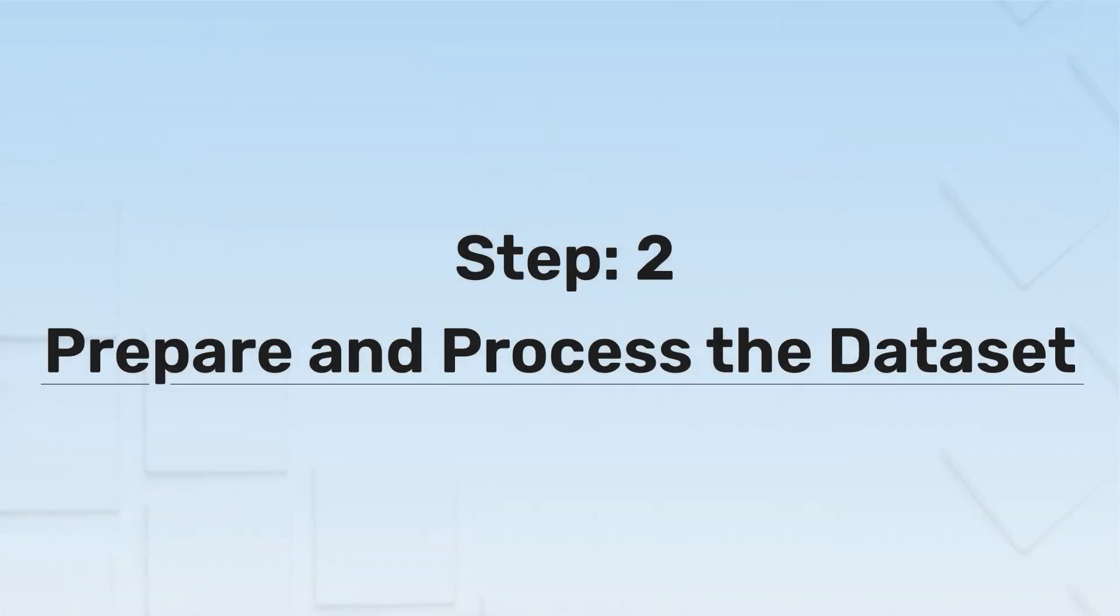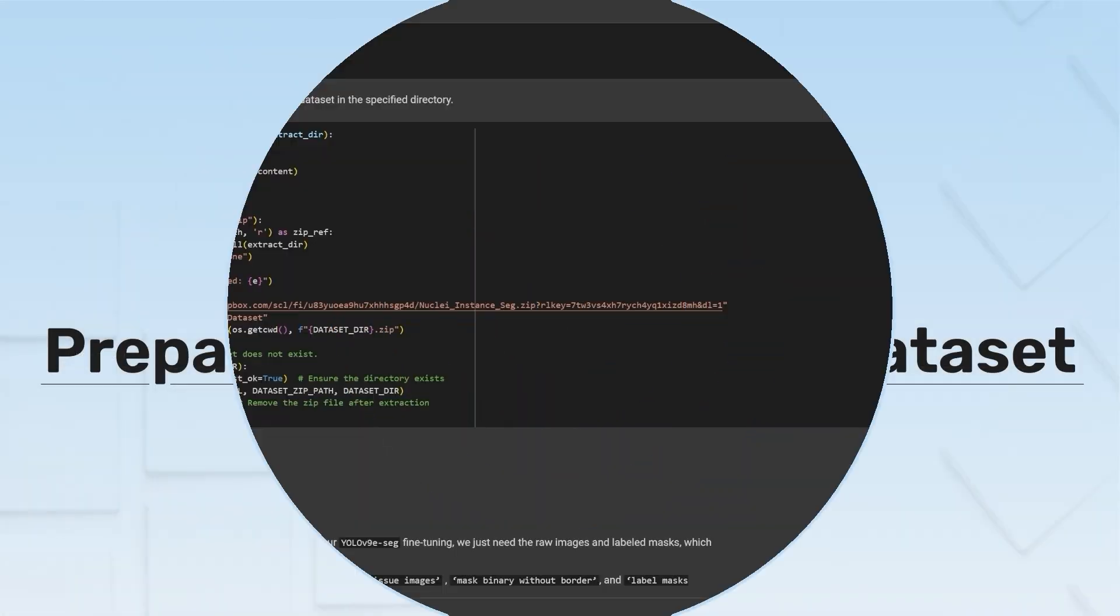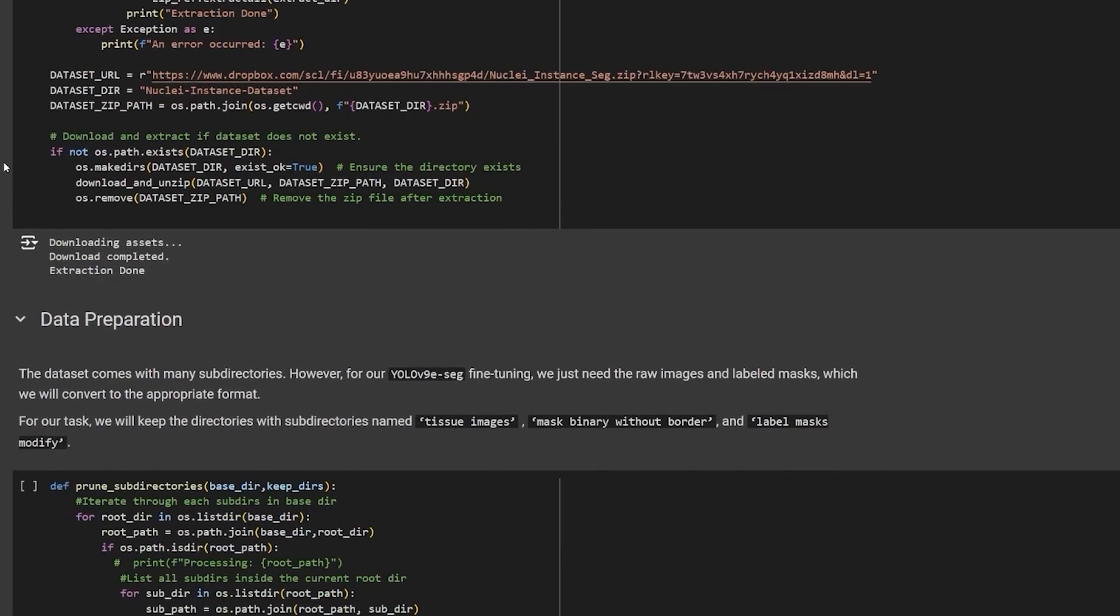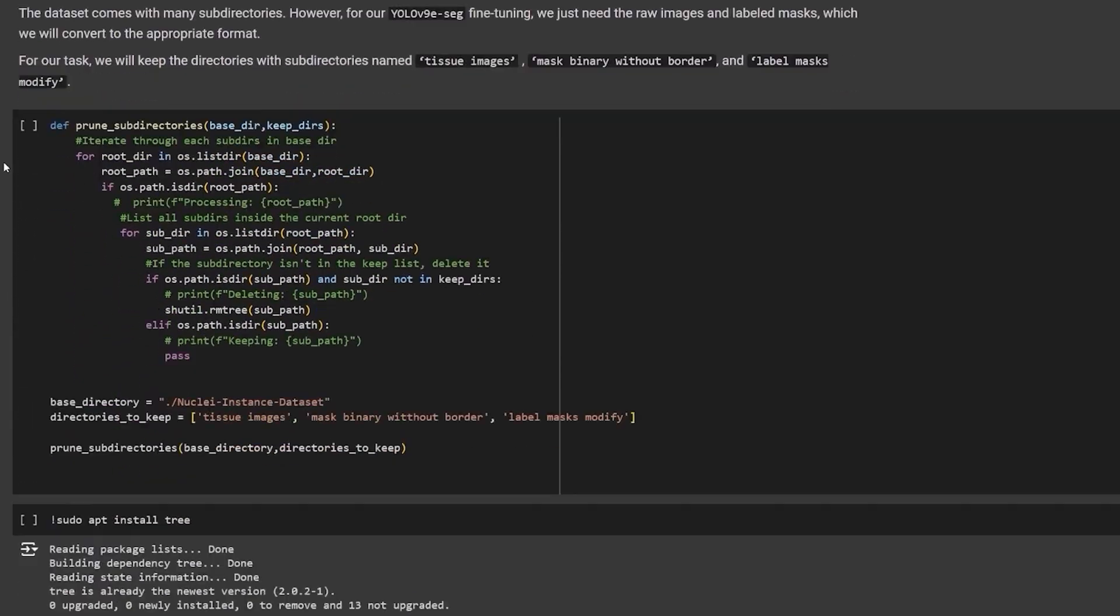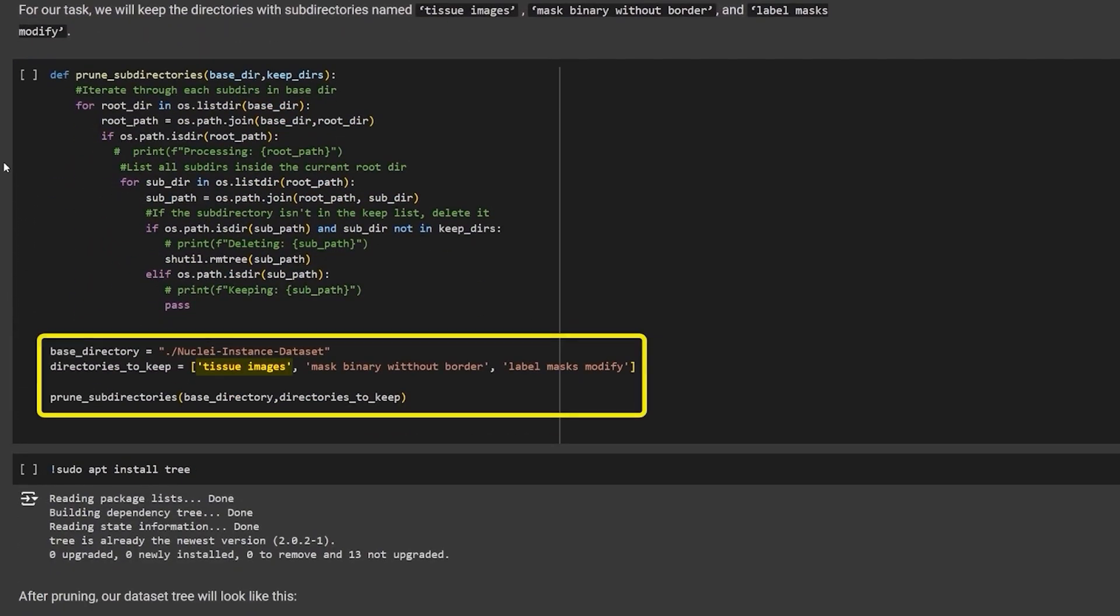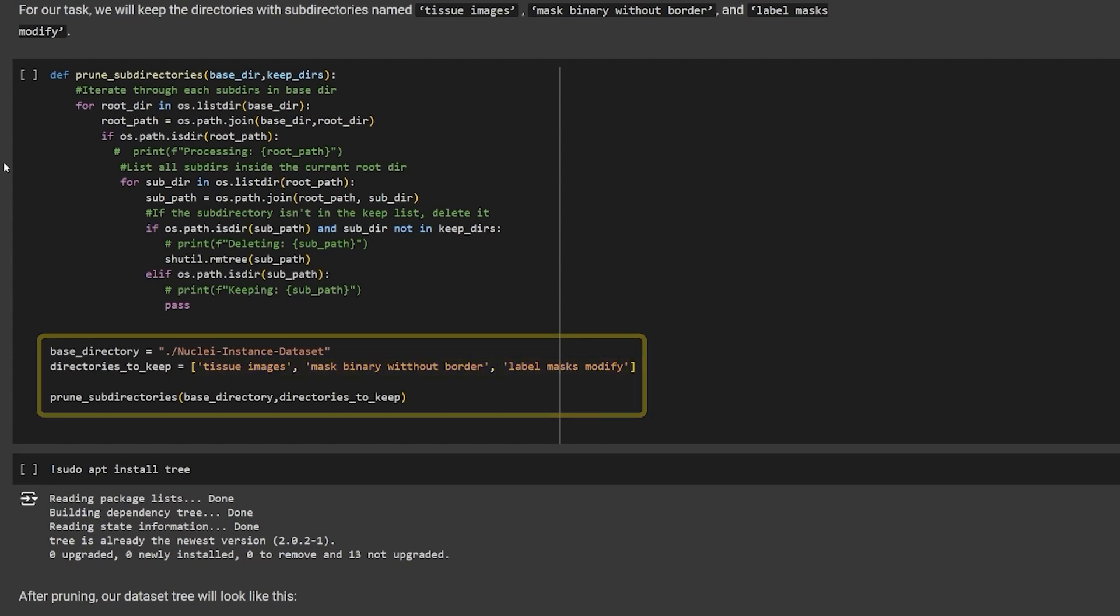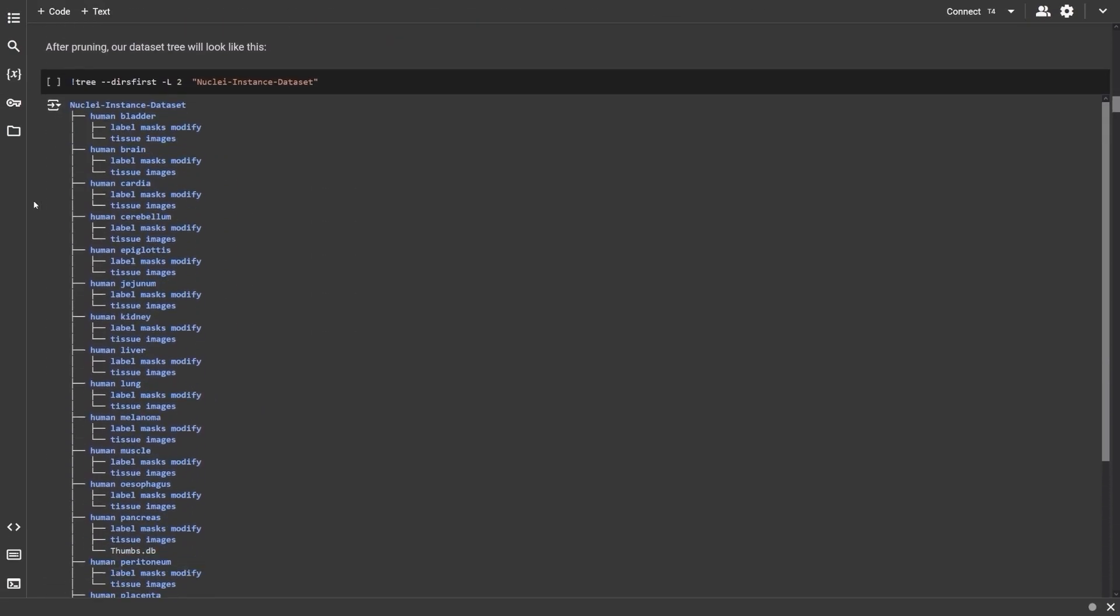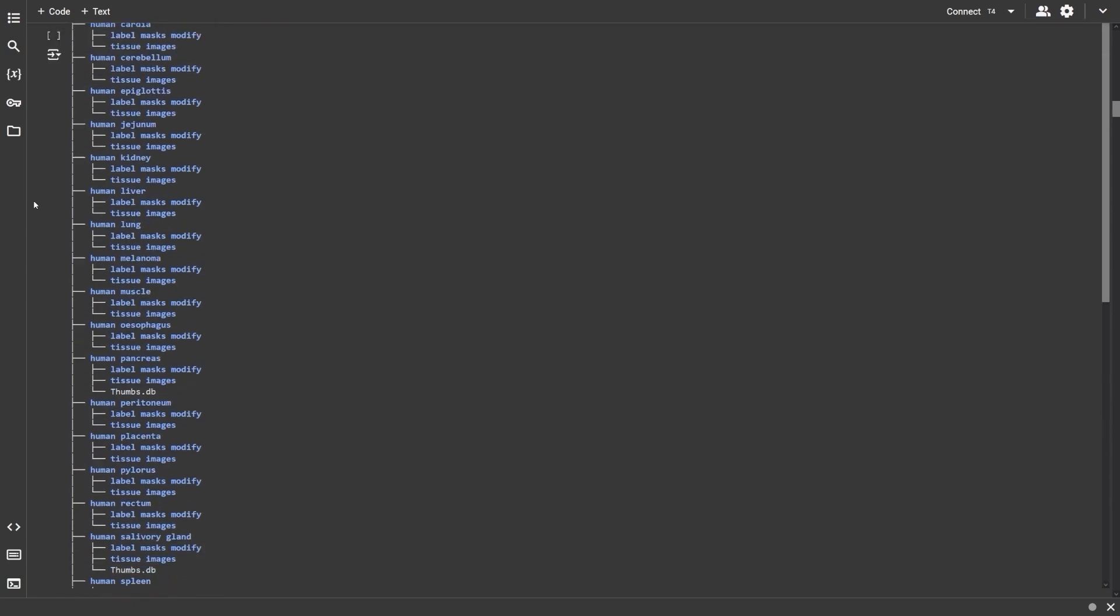Step 2. Prepare and process the dataset. We have provided a convenient Dropbox link to download the dataset. This is an extensive dataset, but we only need the tissue images, its masks and the labels. We'll only keep these folders and delete the rest. After the cleanup, this should be our directory structure. Each organ should have the tissue images and the masks.